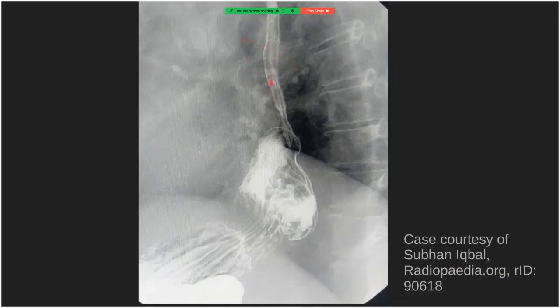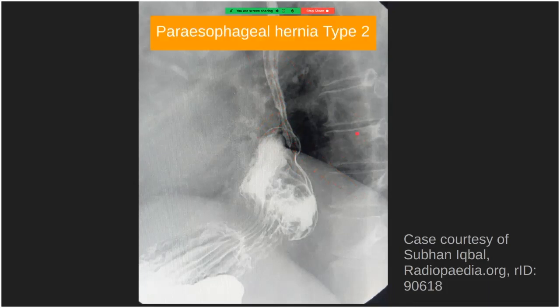This double contrast esophagram shows the lower esophagus, the diaphragm, and the stomach. The GE junction is at the level of the diaphragm; however, the gastric fundus is seen projecting upward into the chest cavity. This is consistent with a paraesophageal hernia — Type 2 hiatal hernia — where the GE junction position does not change; instead, the fundus rolls over next to the GE junction into the lower chest cavity.